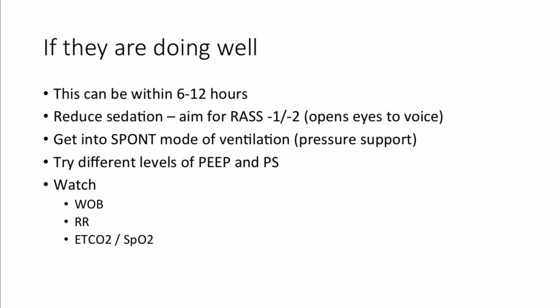You can also get into a spontaneous mode of ventilation. So you're reducing the sedation, you're getting into a spontaneous breathing mode, but you're not trying to extubate them. That's just how you want them to be. We got the first chap into that mode of ventilation quite quickly, and it was really good. That's what you aim to do.